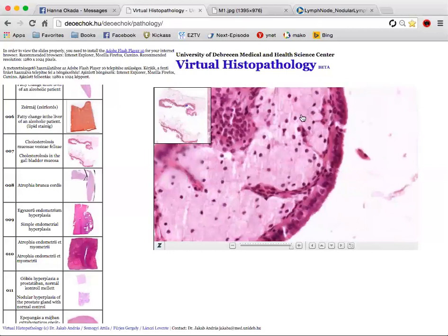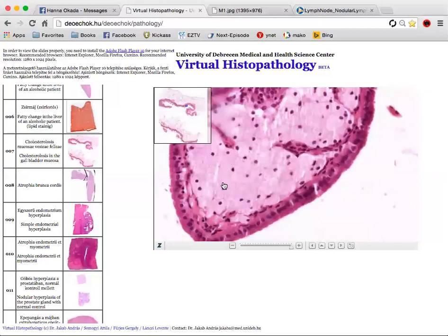Okay. And like macrophage embedded on the cholesterol? This whitish thing is cholesterol? No, it's the cytoplasm and it's full of cholesterol. What they do is they take it up, ingest it, and then they're kind of stuck with it. So what we have to know in this slide is that in the lamina propria we can see the strange material. Could you explain again what we have to say in this slide?